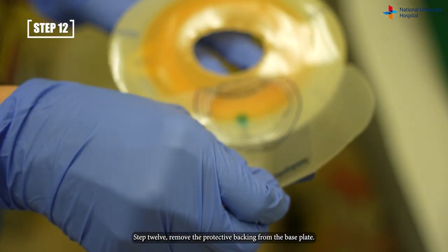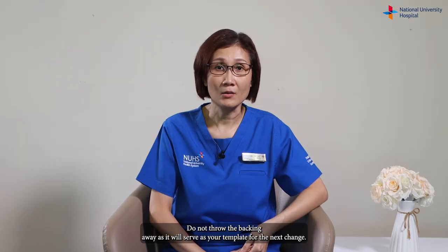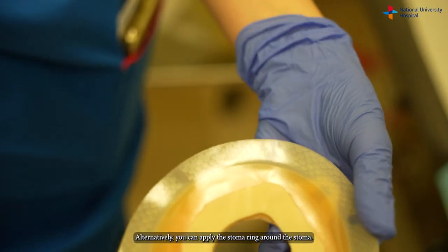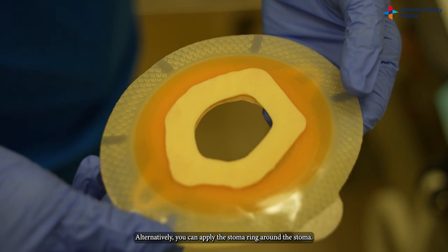Step twelve: remove the protective packing from the base plate. Do not throw the packing away as it will serve as your template for the next change. Step thirteen: apply stoma paste or stoma ring evenly around the cut hole. Alternatively, you can apply the stoma ring around the stoma.